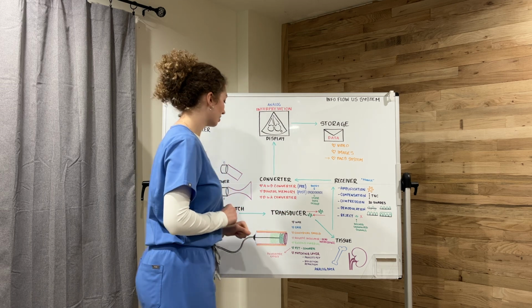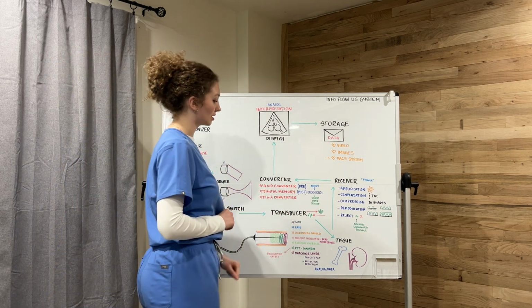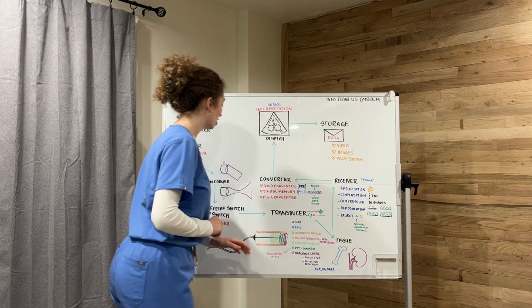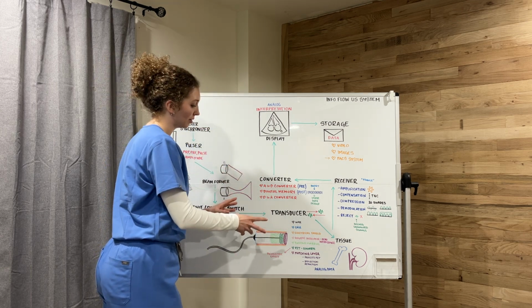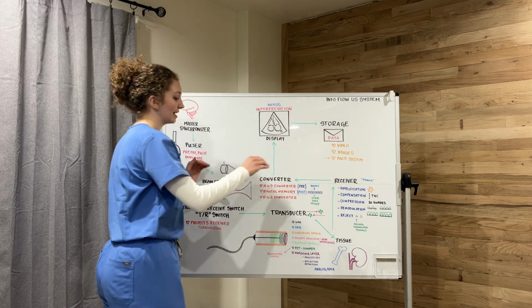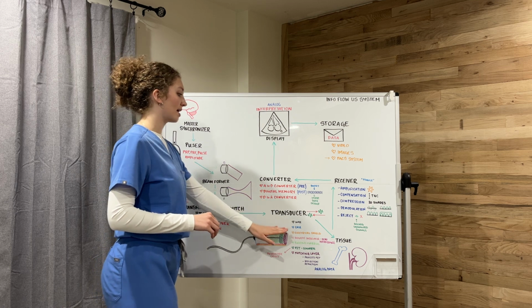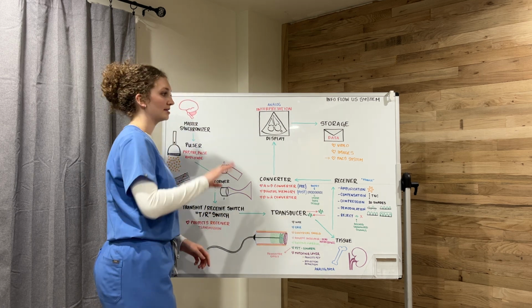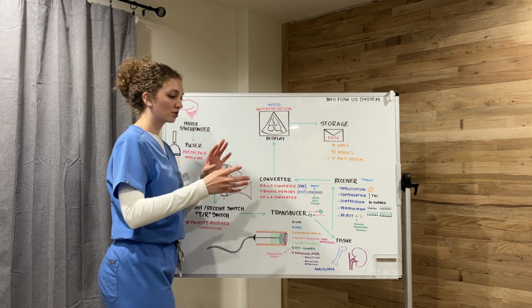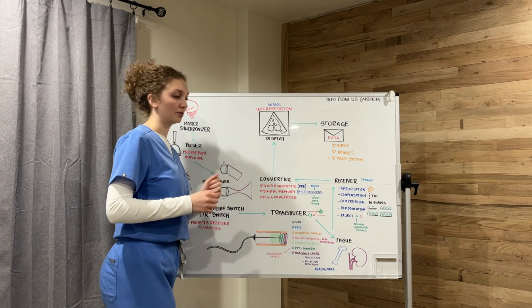We have the wire, which connects the ultrasound system to the PZT crystal. We have the case, which protects the internal components from the external world, and it also protects the patient from internal transducer electrical signals. From there, we have the electrical shield, which prevents the intermingling of the internal electrical impulses and the external electrical impulses.